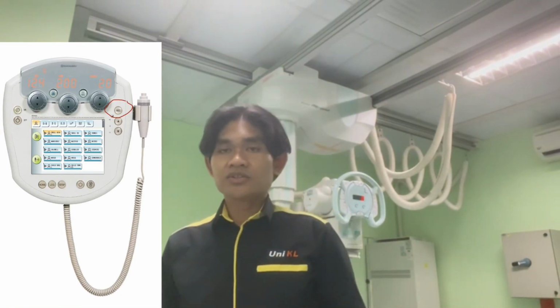For AEC, or we call automatic exposure control, the icon is AEC label or sensor symbol. The function of AEC is automatically adjust exposure parameter to achieve optimal image quality.